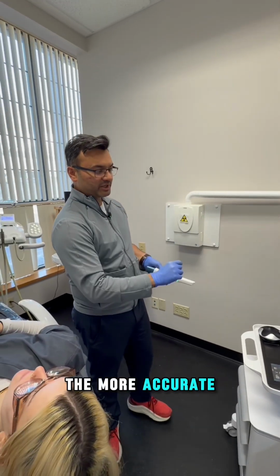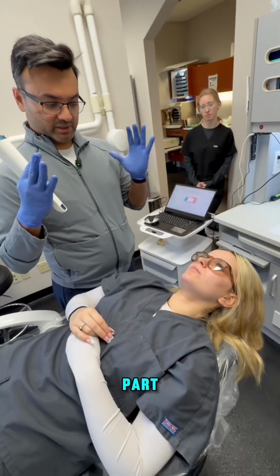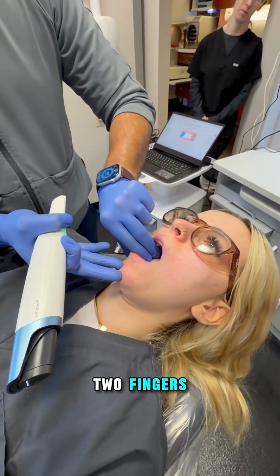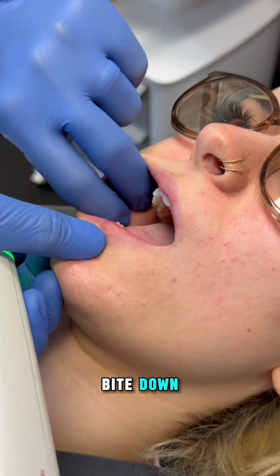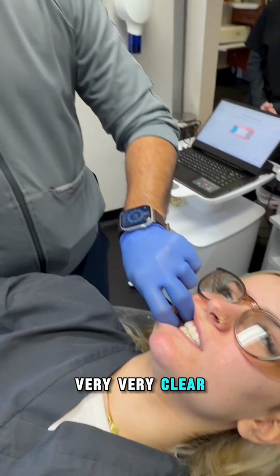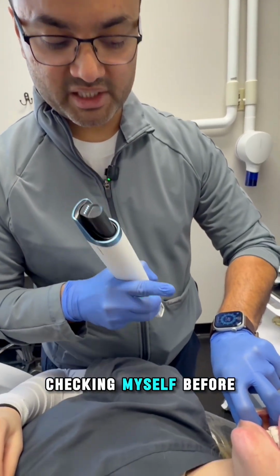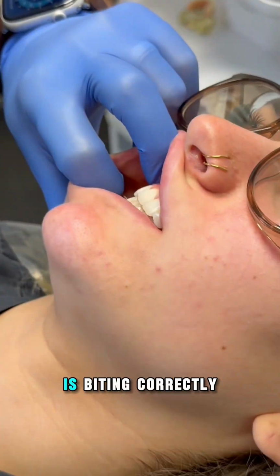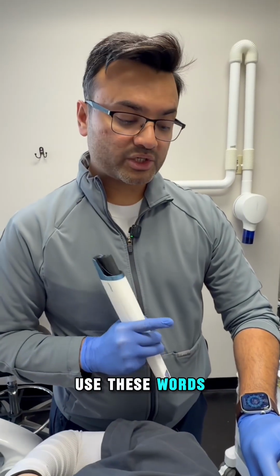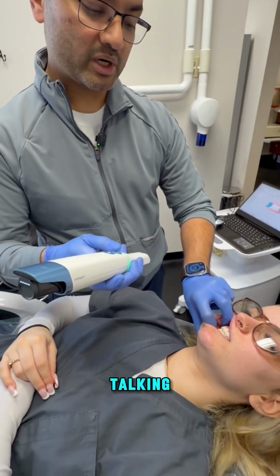Next part. So the more accurate you have your maxillary and mandibular scan, bite scan, second part. Keep the patient in the same position, open wide. Always use your 2 fingers, very gently retract the cheek, bite down. I am very vocal, very clear to the patient in the instructions. Bite down. I am always checking myself before I start scanning that the patient is biting correctly in the occlusion that I want. Then I will use these words: Do not open. Do not move your teeth. You can see how clearly I'm talking.